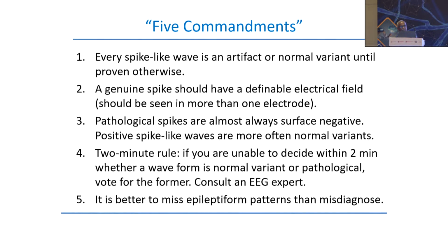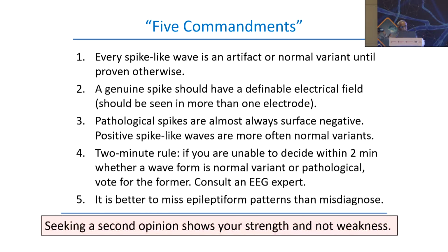Don't conclude that it's pathological, because that has a lot of connotation as far as the management of the patient is concerned. Ultimately, it's better to miss an epileptiform pattern than to misdiagnose, because somebody else who is an expert may correctly diagnose it. But you should not be the person misdiagnosing a benign pattern as pathological.